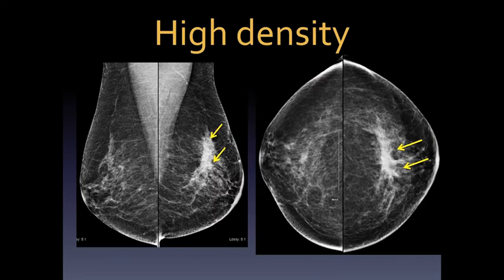In this case, the morphology is somewhat linear and linear branching with coarse heterogeneous calcifications as well, in a segmental distribution. To summarize, features associated with malignancy are pleomorphism — variability in shape, size, and density — linear and linear branching forms, and segmental distribution within one lobe of the breast. Any interval change should be cause for concern and biopsy. In terms of distribution, segmental is most likely to be malignant, with diffuse being the lowest risk.